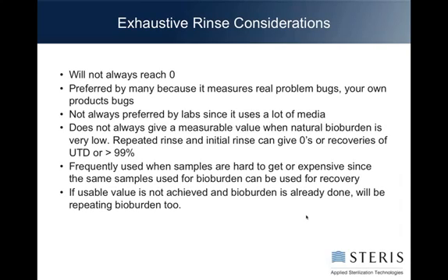Exhaustive rinse, the considerations one has to be thinking about is that it will not always reach 0. You could do multiple extractions and still be getting bugs. It can be preferred by some people because it actually measures the real bugs on your product, not something that you inoculated on there. It is not always preferred in handling because it can use a lot of media because of these multiple extractions.